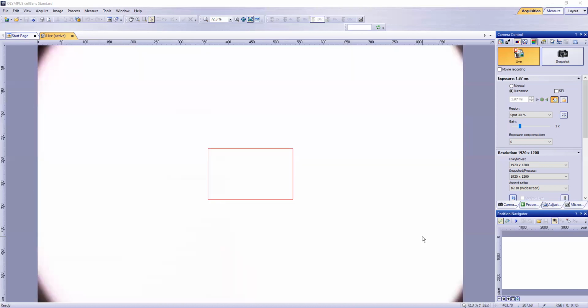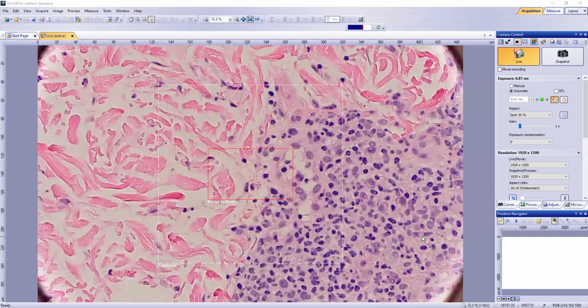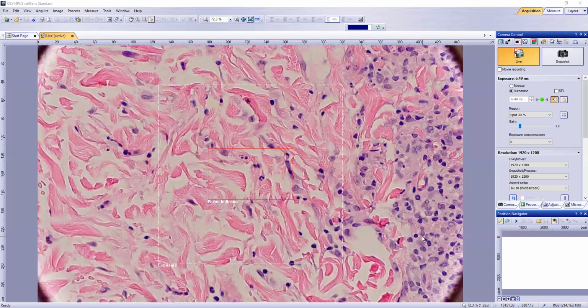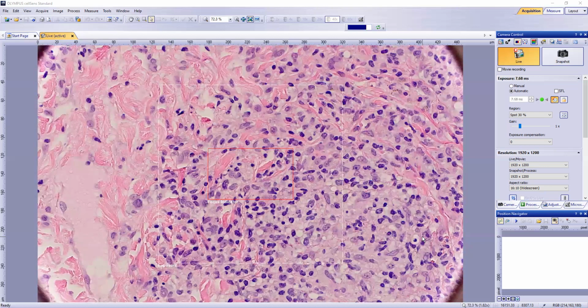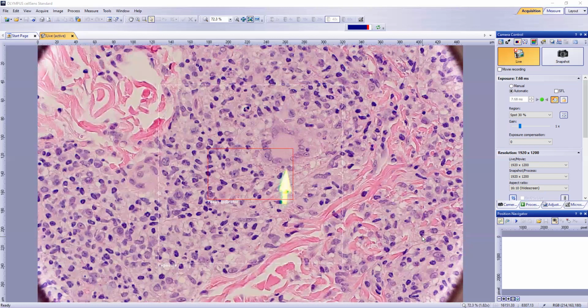So once again, neutrophils in this infiltrate, you can definitely see neutrophils. They're not the predominant cell type, but there's a neutrophil, a nice, perfect polymorphonuclear leukocyte, a neutrophil there. And as you look closely, you'll see neutrophils throughout this infiltrate. So this is a great feature for syphilis, the presence of neutrophils. Another feature, oh, there's a beautiful multinucleated giant cell there.